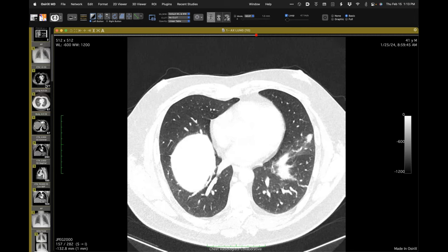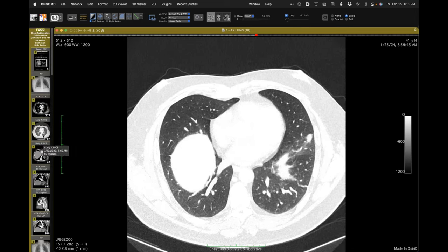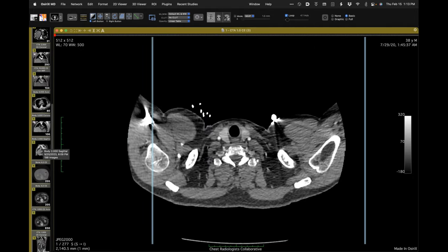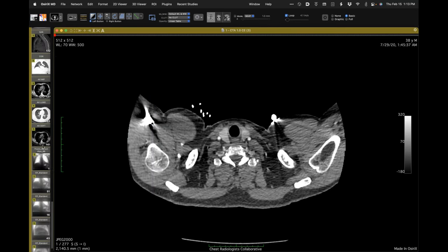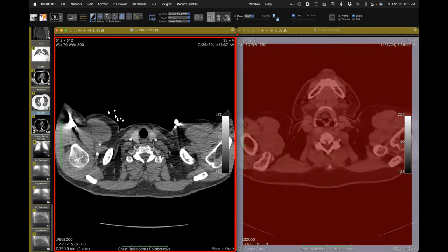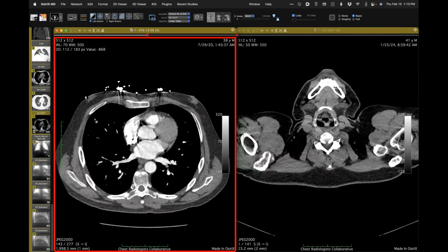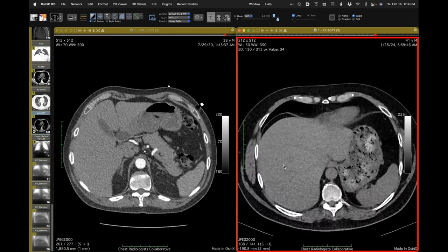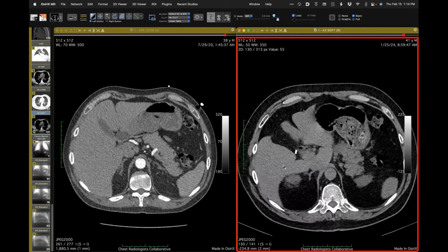We have a previous CT for comparison. Asking the question of what the hemi-diaphragm muscle looks like today on the most recent CT — with respect to the possibility of a substantial and durable injury of phrenic nerves — we can evaluate the bulk of the hemi-diaphragm muscle including the posterior hemi-diaphragms and the crura. I don't see the kind of atrophy I would expect if the phrenic nerves were not functioning.